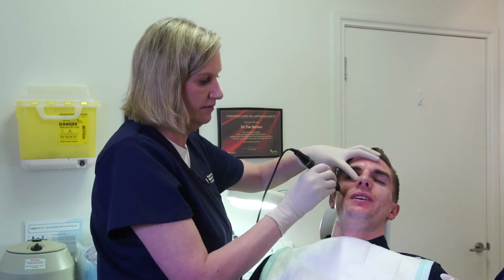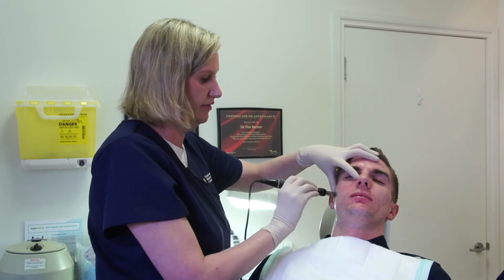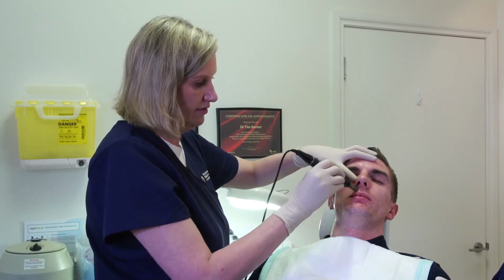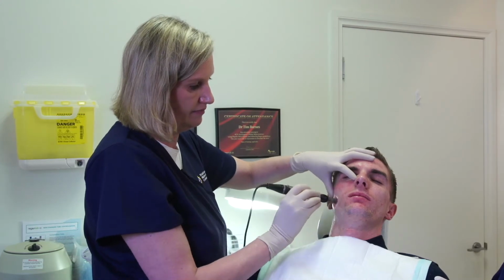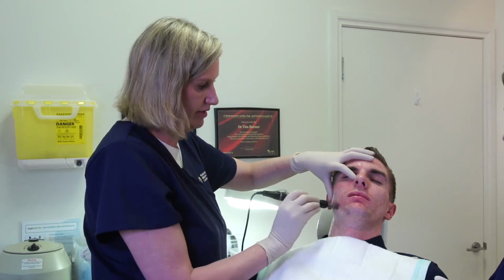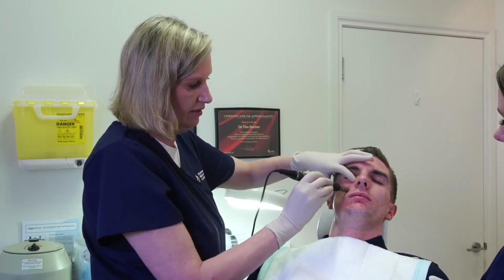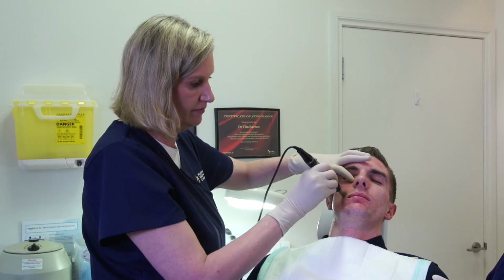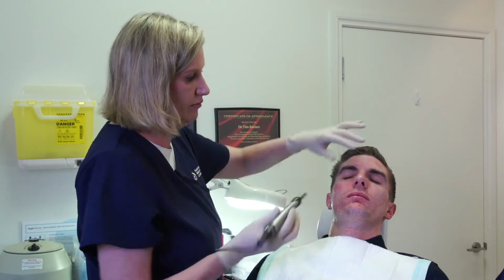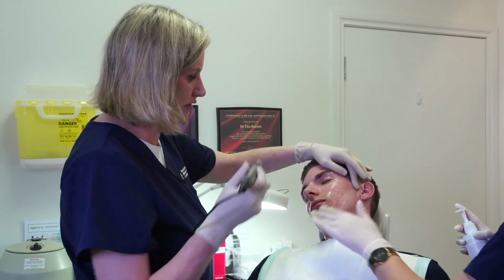How are you feeling, Josh? That's good. As it passes over the areas where the nerve foramens are, you can get a bit of a zing. Warn the patients they can expect that. You're just aware of it, doesn't really hurt. And we really want to keep going until we start to see a little bit of that flushing happening in the skin. You can see there's a little bit of pinpoint bleeding already from that 0.5mm depth. And just work each segment of the face like you would a chemical peel in the sort of cosmetic units.